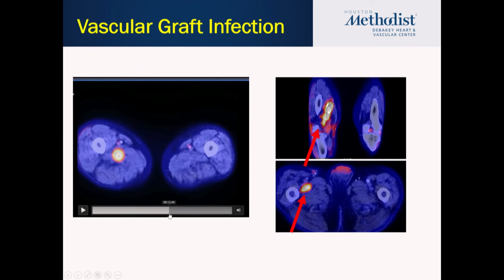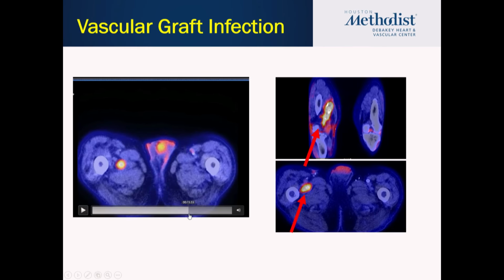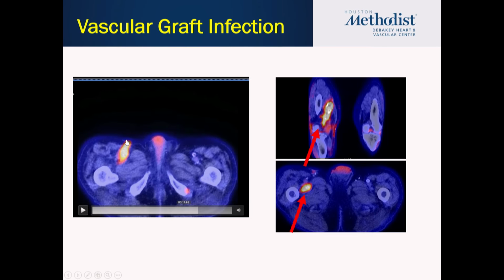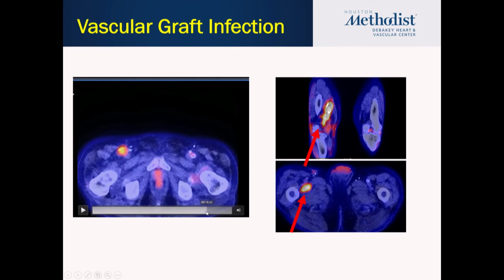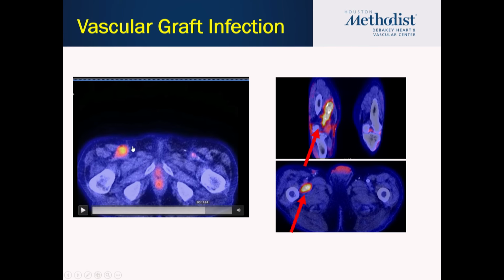Exactly. And now we're moving up, all the way to the groin. We're moving up, and you can see it here. We did the reconstruction, and you can see all this intense inflammation, potentially infection, that you don't see here. And this patient actually has a very bad infection that you can see all through here. So now you have the contralateral side to guide you, telling you this would be an acceptable level, but this one is clearly much different between the two.